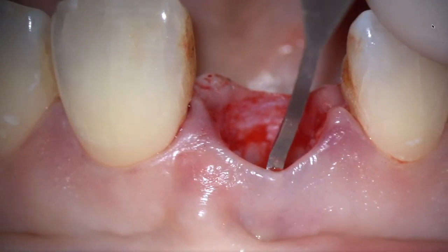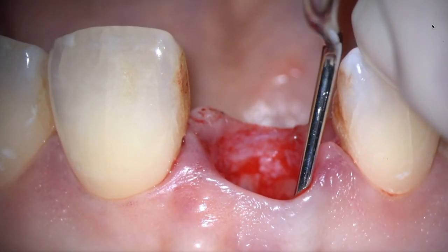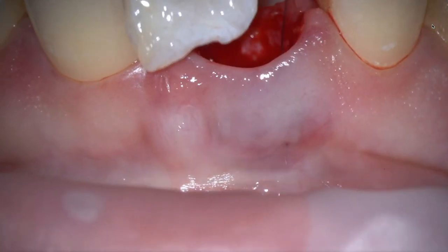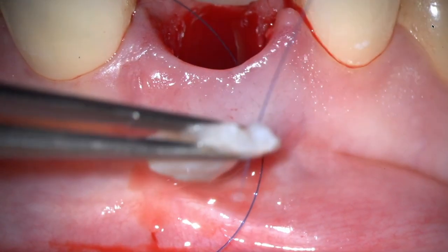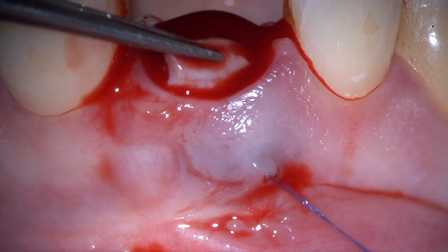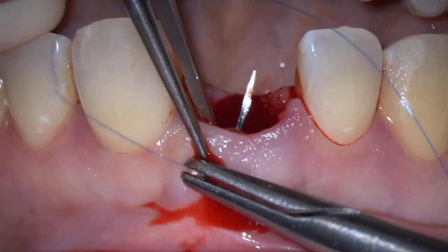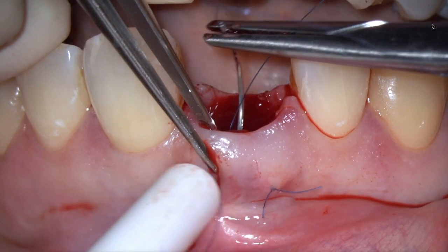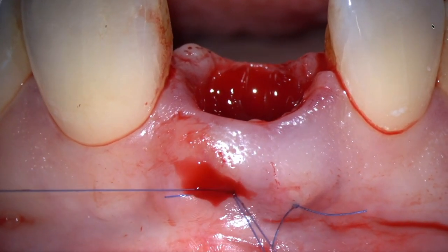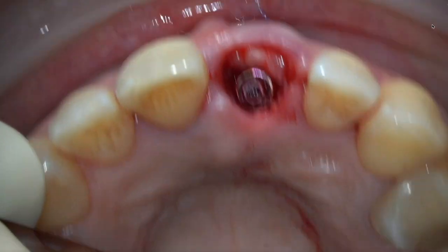Here I'm opening the periosteum and then going with a tunneling instrument, preserving the periosteum on the flap. I don't care about leaving the periosteum on the bone and creating partial thickness, because this bone is going to resorb anyway. For me it's much more important to have the periosteum in the flap, because it will feed my graft. I'm going to use two marionette sutures — one from the distal, one from the mesial — to stretch the graft over the buccal bone and just slightly underneath the soft tissue margin. The ideal situation is for the connective tissue graft to be about one millimeter under the final margin.